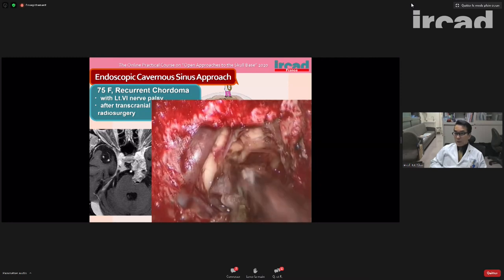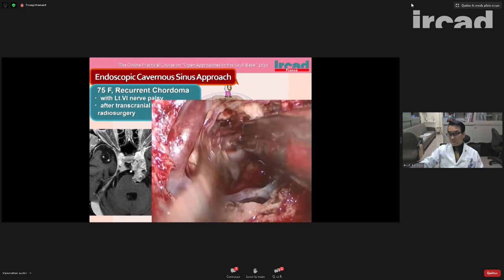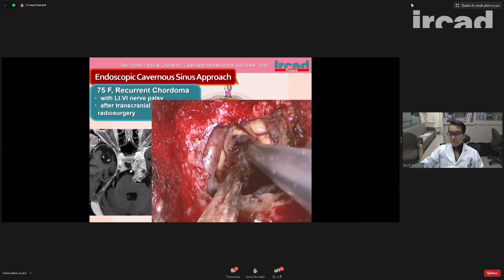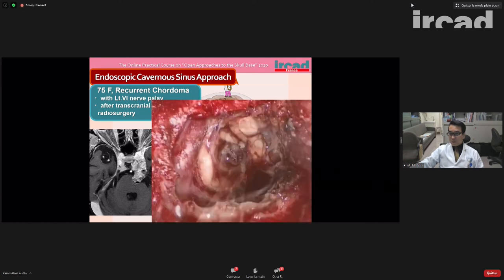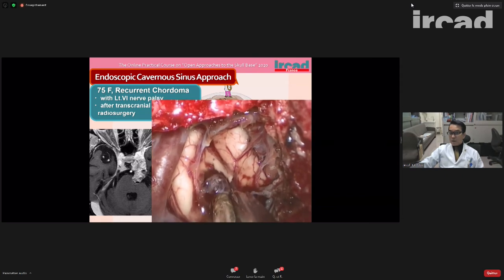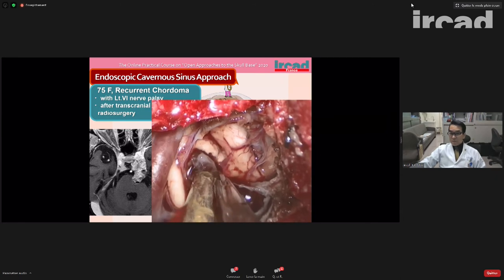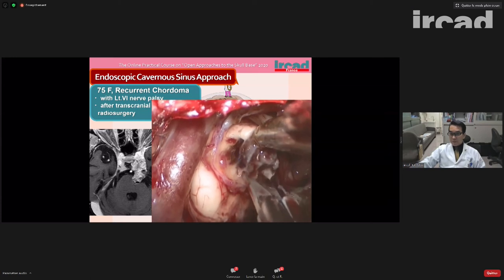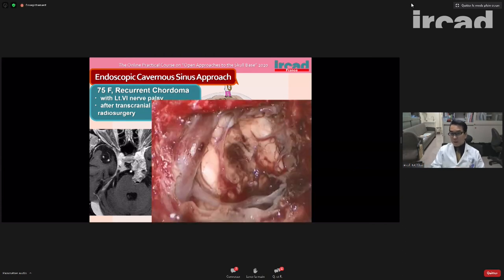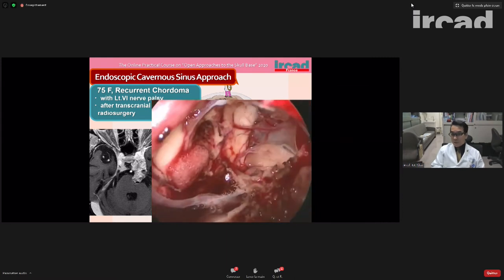So we remove the tumor, dissecting from the pia mater, using the Cusa. And a small residual lesion is also dissected from the brainstem. I think it's okay if we dissect from the pia mater. It never injures the corticospinal tract. In this case, we could achieve the total dissection, and she didn't have any neurological complication, but her abducens nerve palsy didn't improve.